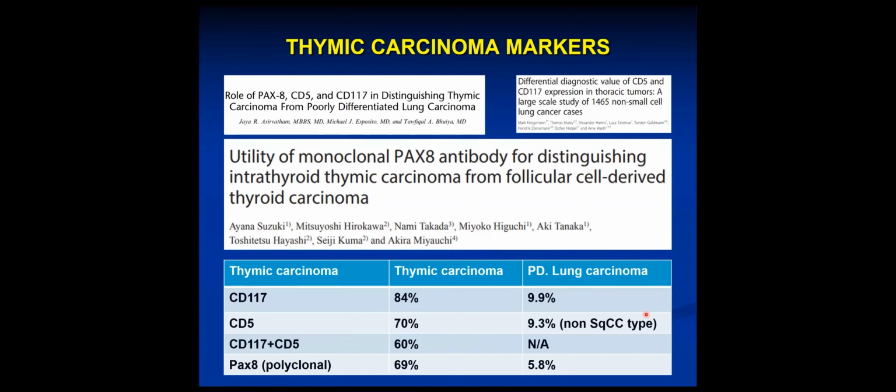There are some additional thymic epithelial markers that I recently noticed in the literature, like FOXN1 and CD205. They might be valuable in confirming the thymic origin. However, these markers might not be readily available because they are not available in our lab. Let's move on to lung.